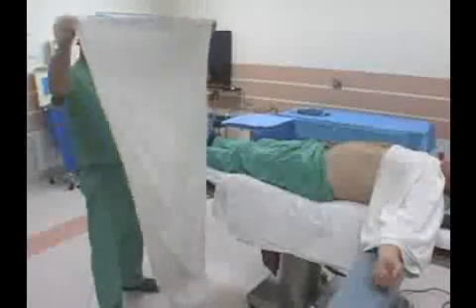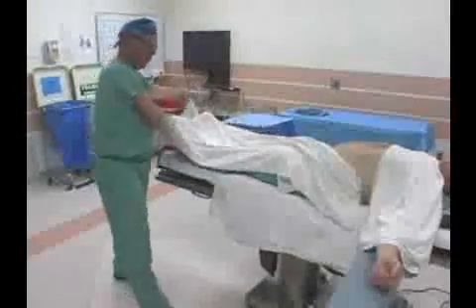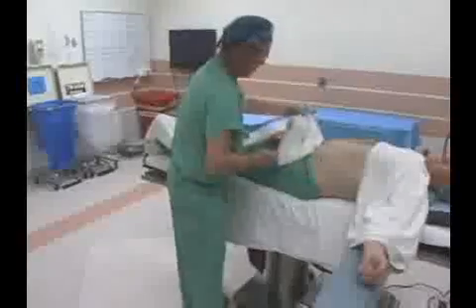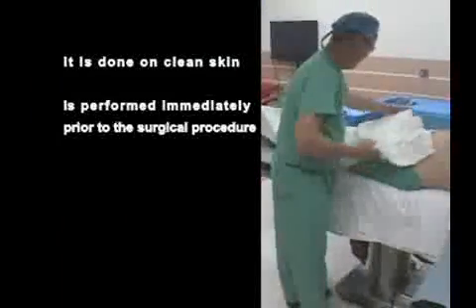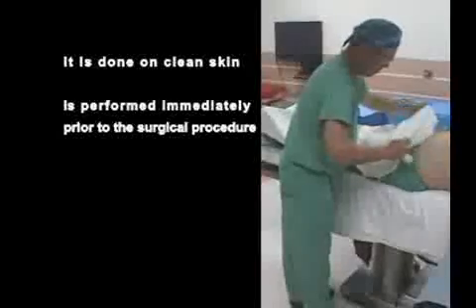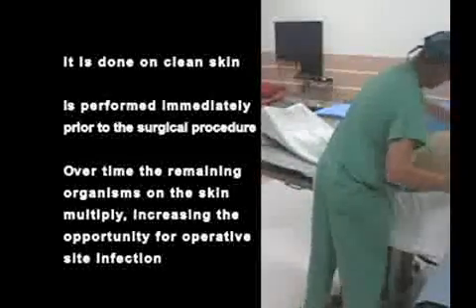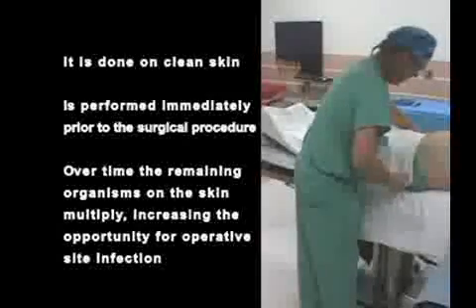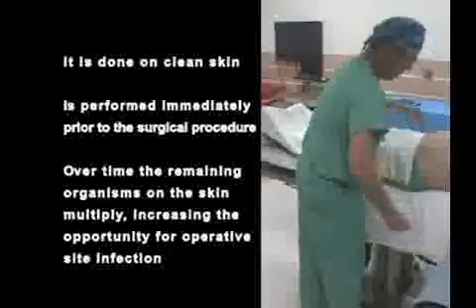Like the hand scrub, the surgical skin prep is done to reduce the number of surface organisms to the lowest possible number. It is done on clean skin and is performed immediately prior to the surgical procedure, because over time the remaining organisms on skin multiply, increasing the opportunity for operative site infection.